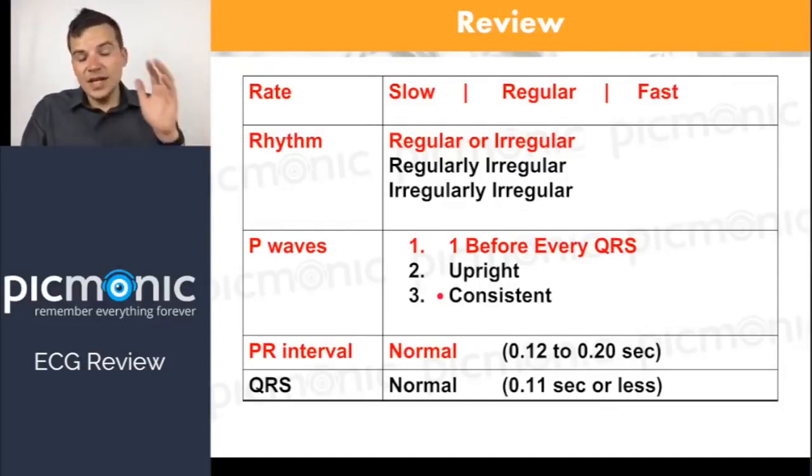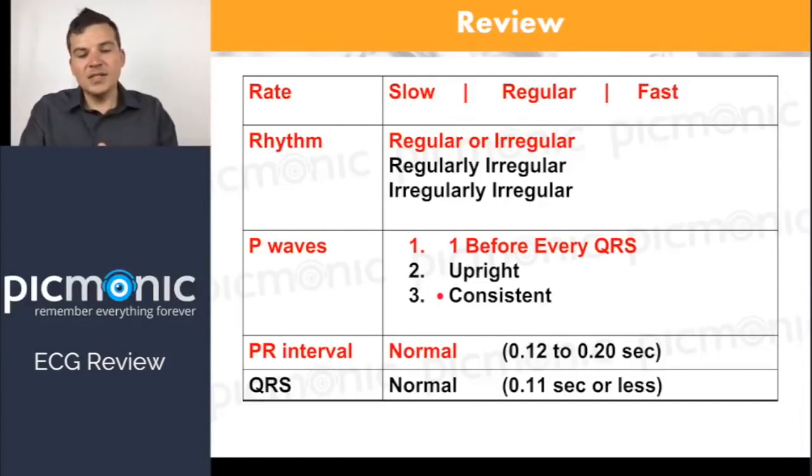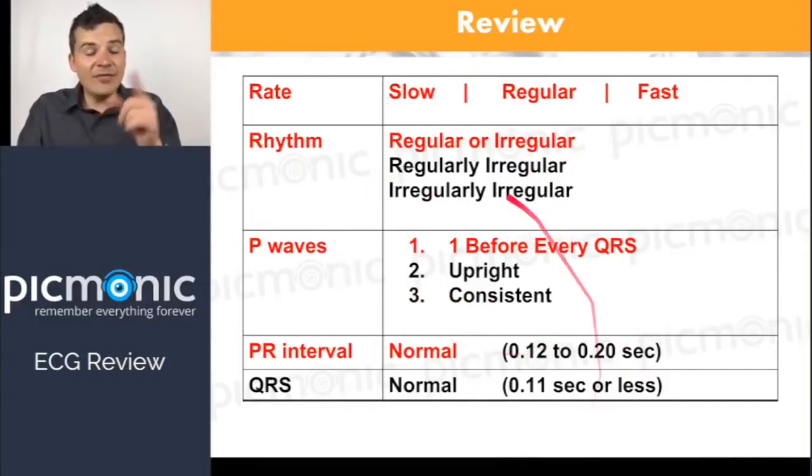And then look at the QRS last, which, depending on what book you look at, is 0.10 to 0.12 seconds or less, or three small boxes. If you're seeing wide QRSs, those are usually ventricular arrhythmias. And that's just what you know. And as I think Jack mentioned earlier, after any kind of ventricular arrhythmia, we usually give lidocaine, and that's right.